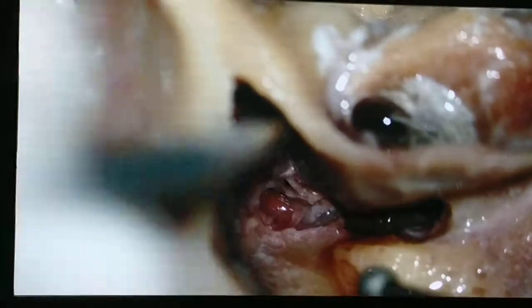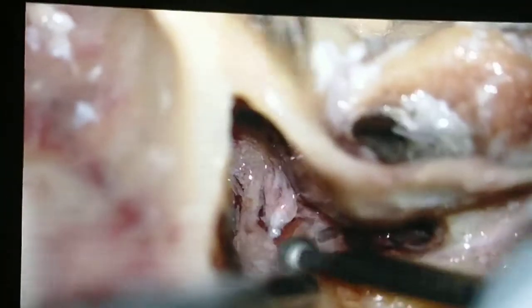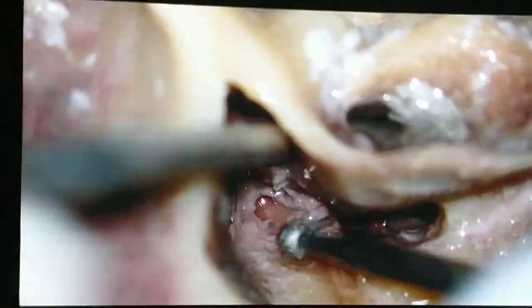Usually when you fracture the process cochleariformis, you immediately get the nerve medial to it. But in this case, I think I didn't go deep enough. I have to fracture it at the base of the process cochleariformis.